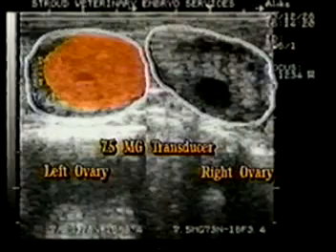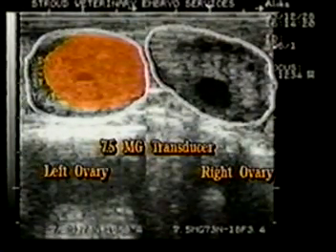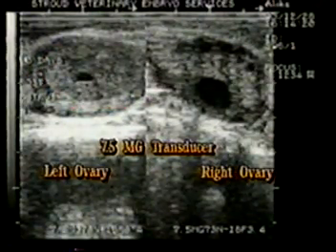The white line represents the borders of both ovaries. The red area on the left is superimposed over the luteal tissue.